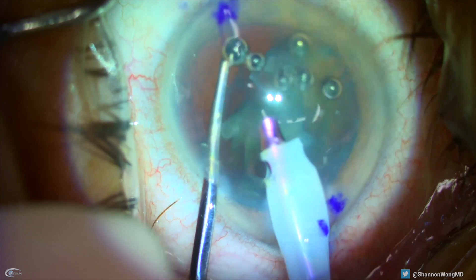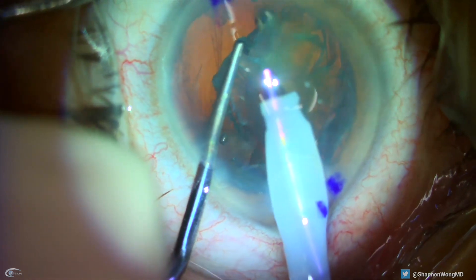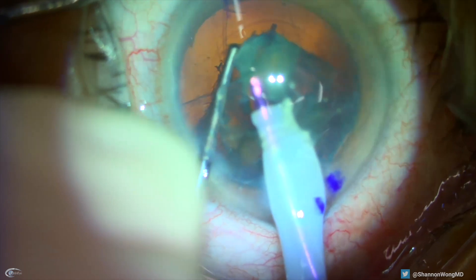Interestingly, it's not until 14 seconds later that I realize that there's a break in the posterior capsule. I can see the vertical break in the posterior capsule from 12 to 6 o'clock.